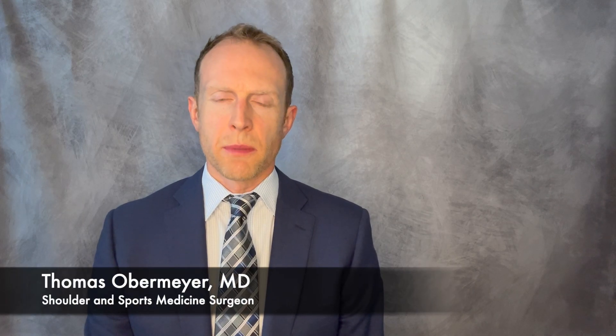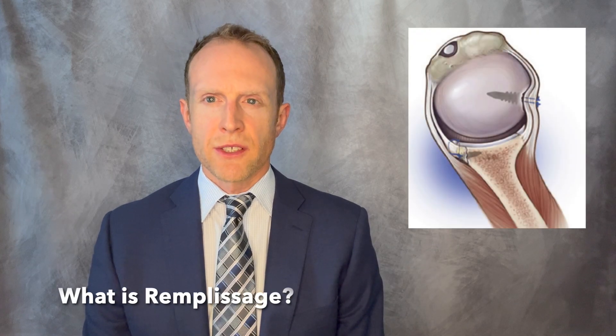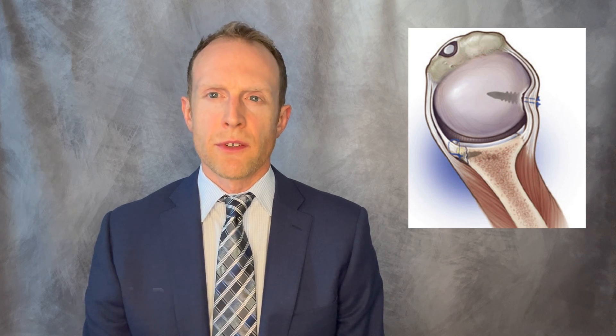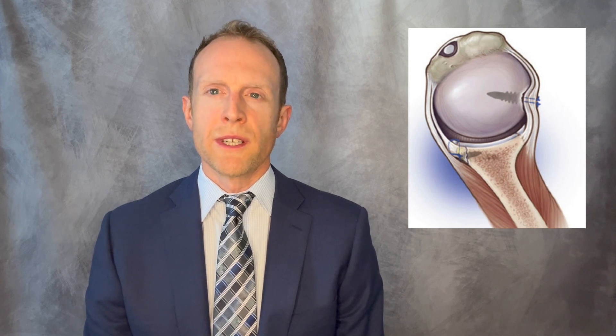Hi, I'm Dr. Obermeyer and the purpose of this video is to review arthroscopic remplissage. Remplissage is a French term meaning 'to fill in' and in this case specifically refers to a minimally invasive adjunct procedure performed for shoulder instability or dislocation, where there is treatment performed of the Hill-Sachs, or dent fracture, of the back of the ball known as the humeral head.